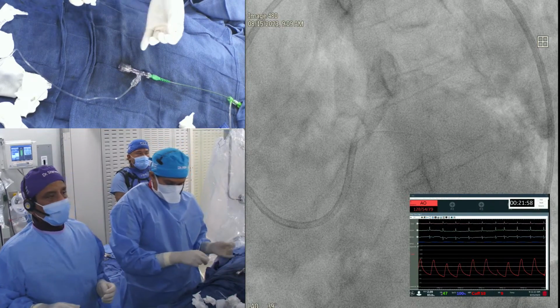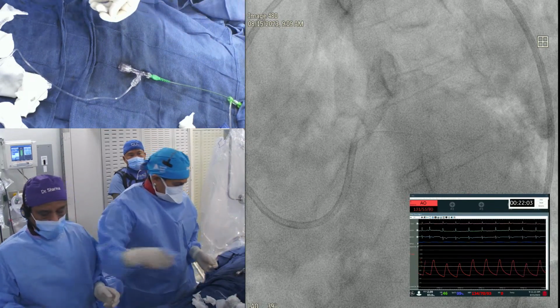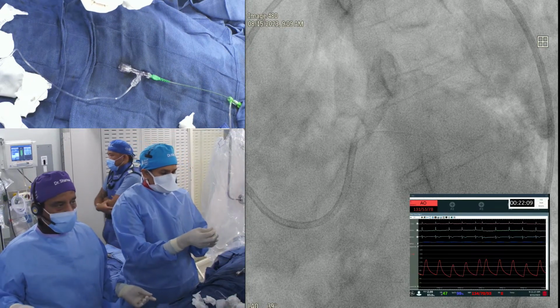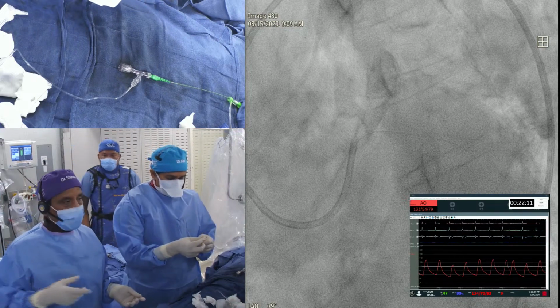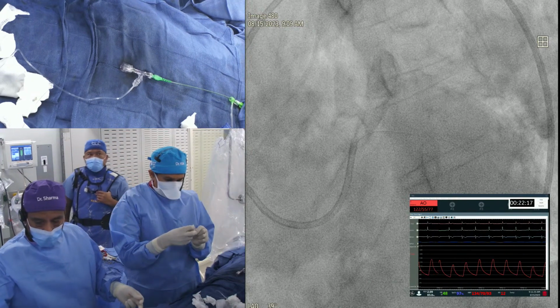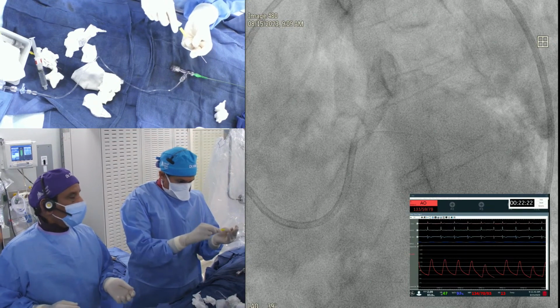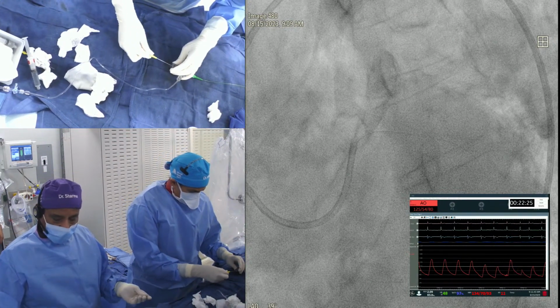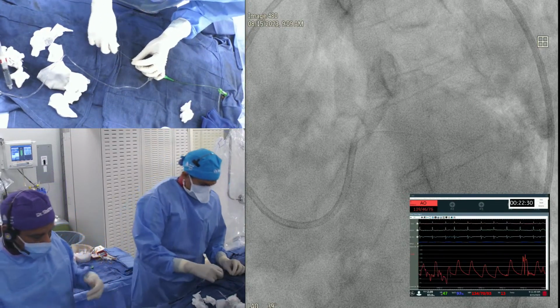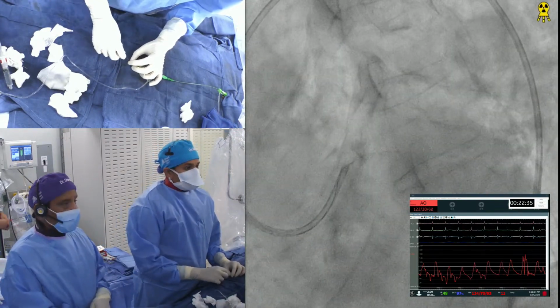So here you can do a few things. One, if you want to go, you have your Corsair. Of course, the first thing is, to me, we used to use all these stiff wires and there's no need. You can put a balloon and put your guide liner or Godzilla further and then your stent will go. Secondly, you can go to a stiffer wire, like the Grand Slam and other stiffer wires, and change it on your Corsair. Third, which I'm going to do, parallel side by side. Now, since we have opened the lesion and the vessel has become a little straighter, it has a good chance to go. I know initially it was tough to advance, largely just because of angulation.